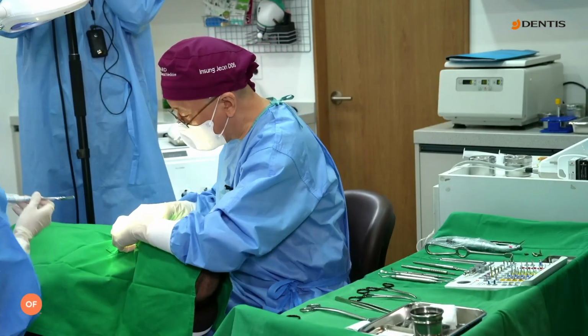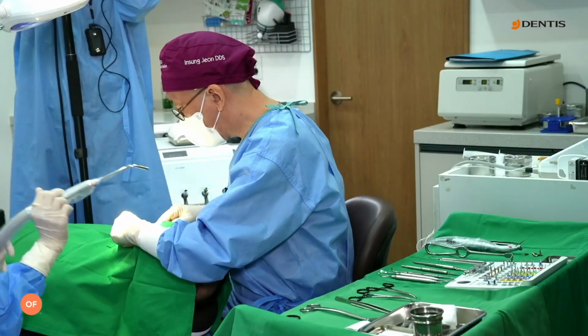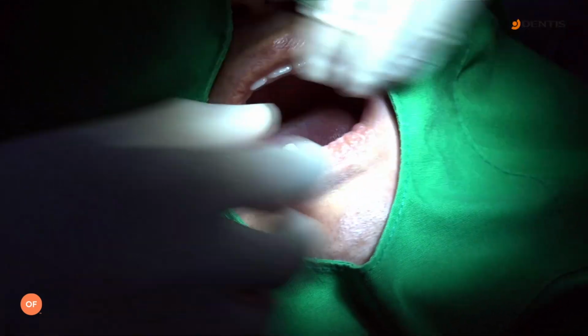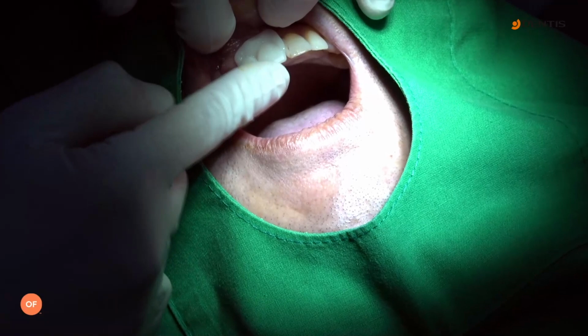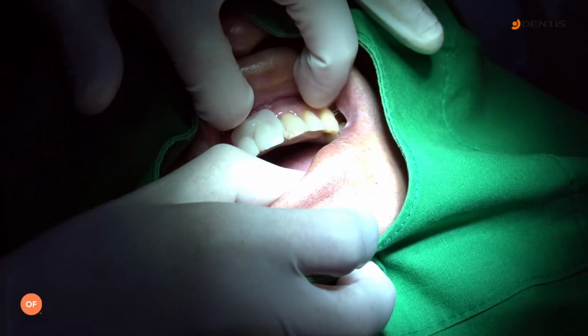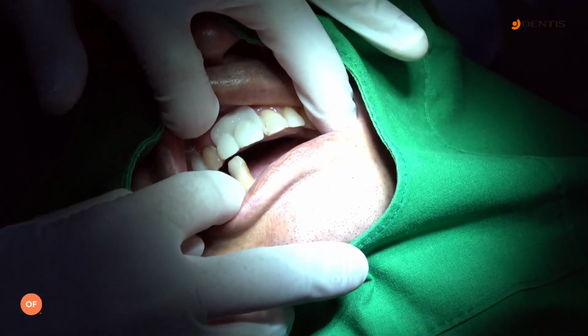This patient is a middle-aged man with just 2 teeth remaining in the lower jaw. So this is the hopeless tooth. And then this is the immediate denture by the split tray technique. With this one, I made an arbitrary vertical dimension already.